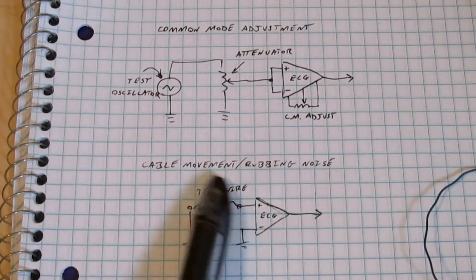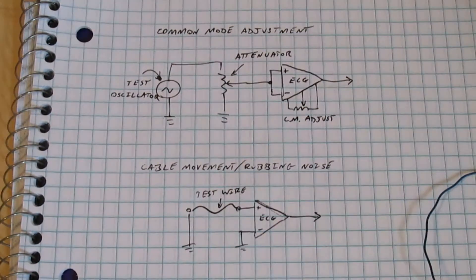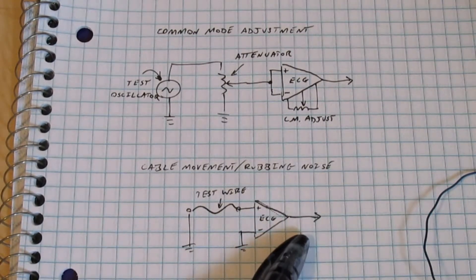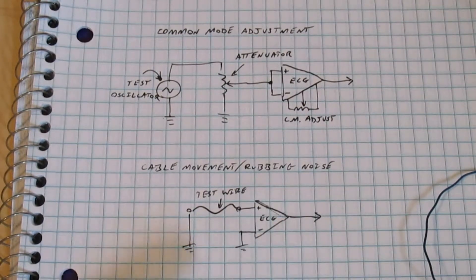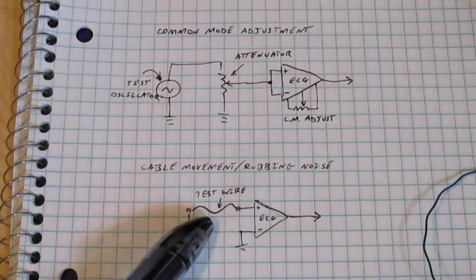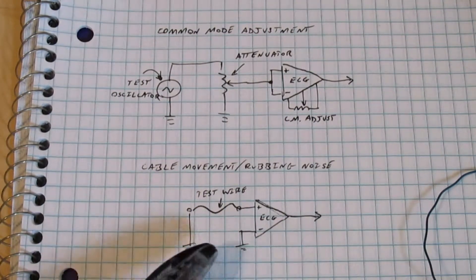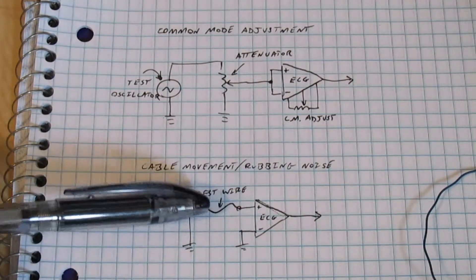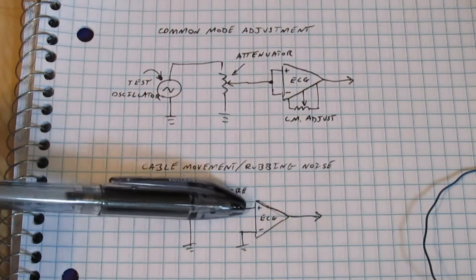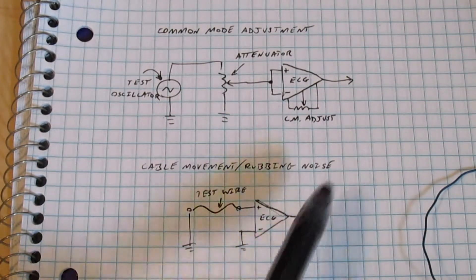I'm going to try some wires with a few different types of insulation and see what kinds of differences they have. The reason I don't think it's static electricity is because I did not see a DC offset at the output when I only rubbed one of the wires. With static electricity, when two things rub together, electrons get rubbed off of one thing and onto the other, which means there's going to be a charge buildup. So if that charge buildup is only on one of the inputs of the ECG, that should translate to a DC offset at the output — but I didn't see that.